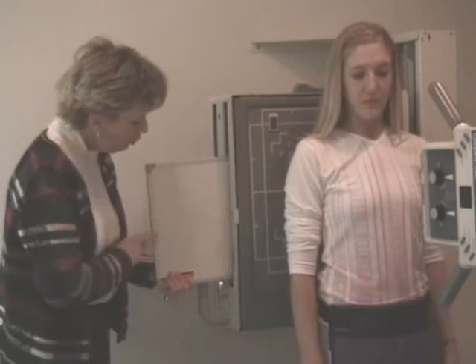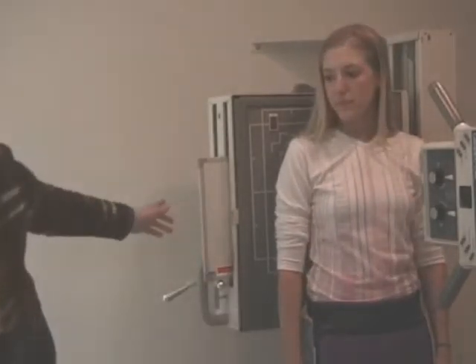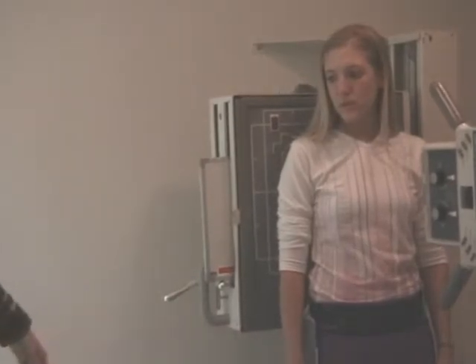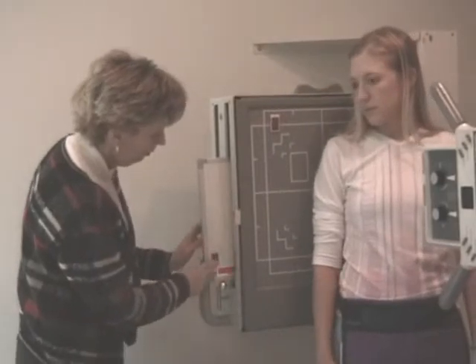I'm putting a 10 by 12 in the Wall Bucky. I'm going to use a right marker. I'm going to put the right marker, the right side right there.